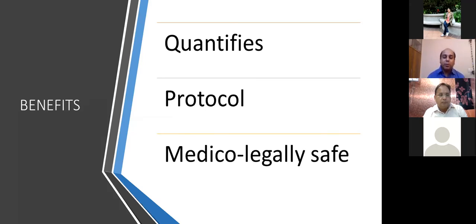This desired outcome means whether the Down syndrome is present or not present. This helps us in communicating and convincing the patient to go for higher tests, which may be costly to his or her pocket. And once they are convinced, then we set a rapport with the family. This rapport helps us to overcome any potential medico-legal problems. So this risk assessment is very necessary in TIFA scan.